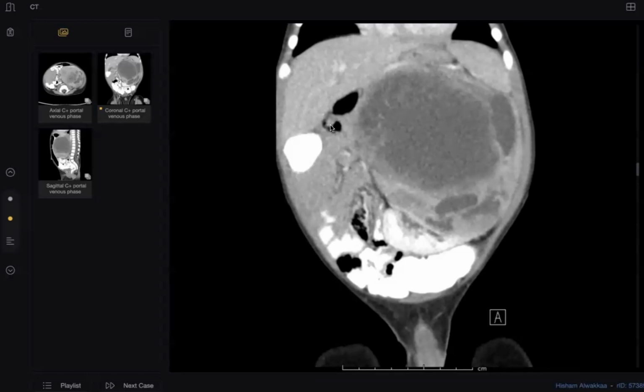I told you before about one case I presented in the long reporting. It was really so confusing, plus the additional exam confusion. It was a HIDA scan, and you can see the gallbladder and a little bit dilated CBD. I told myself I'm not an expert in HIDA scan. HIDA scan means biliary atresia.